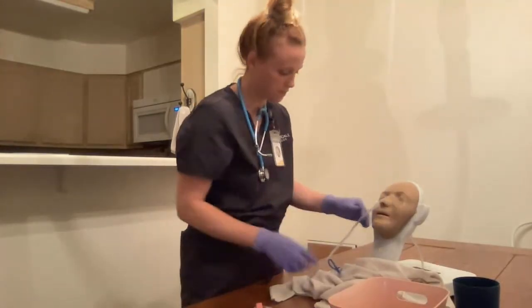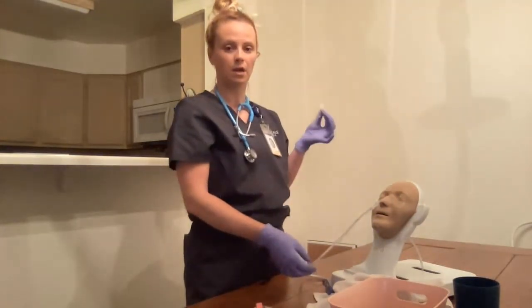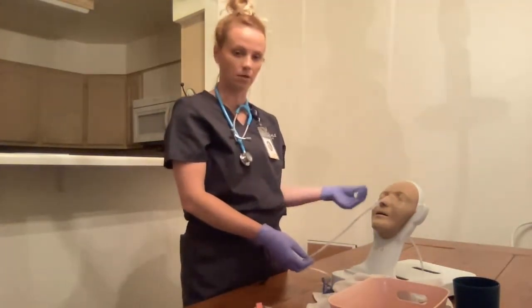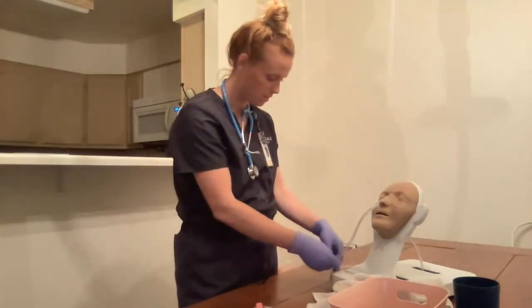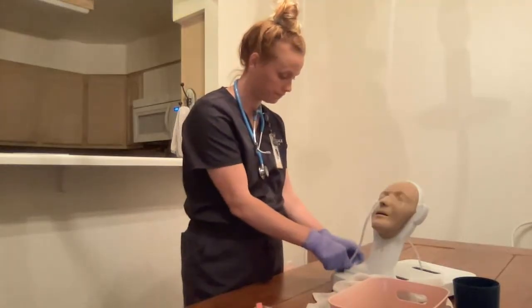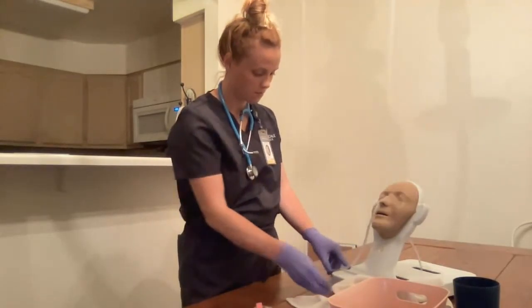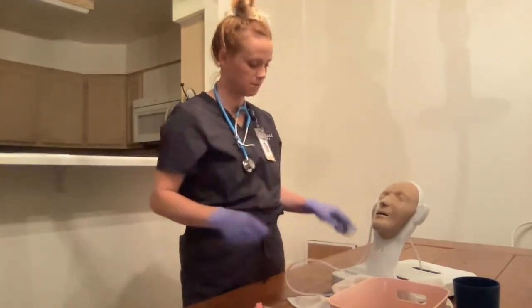All right, Mrs. Smith, is that comfortable? Good. All right, typically in the real world, we would have tape and a safety pin to hook to the gown. I don't have a safety pin, so I'm going to use tape. I'm going to hook to my patient's gown here. All right, everything is in place.